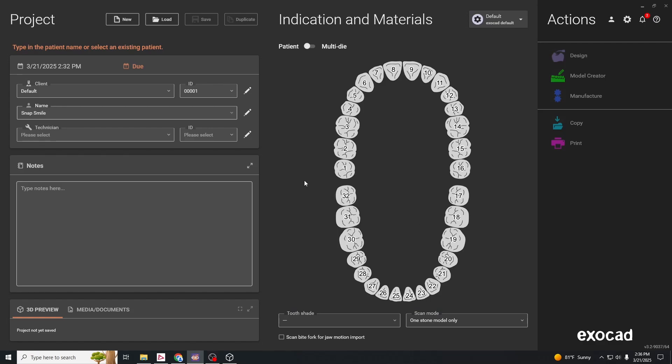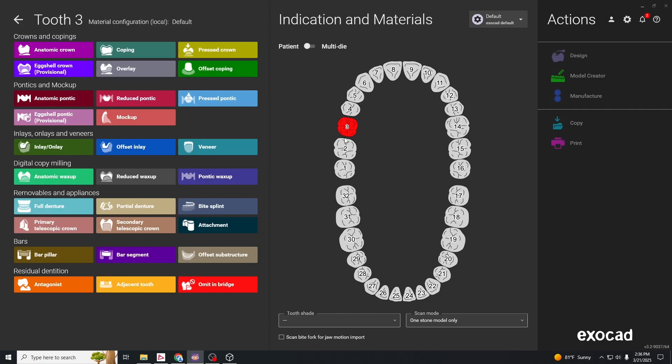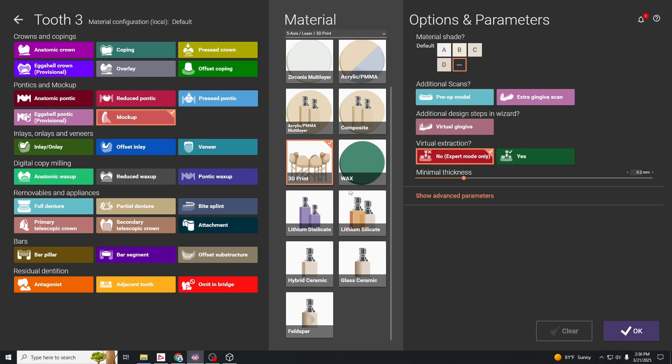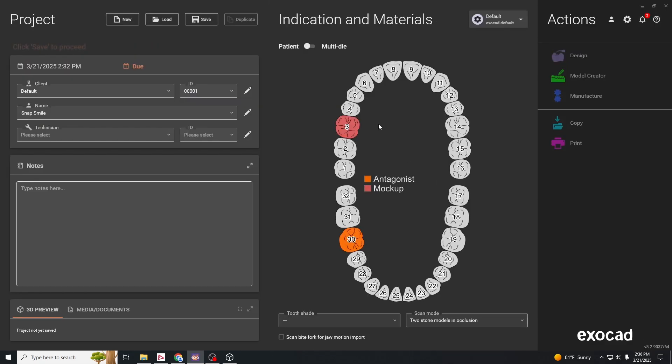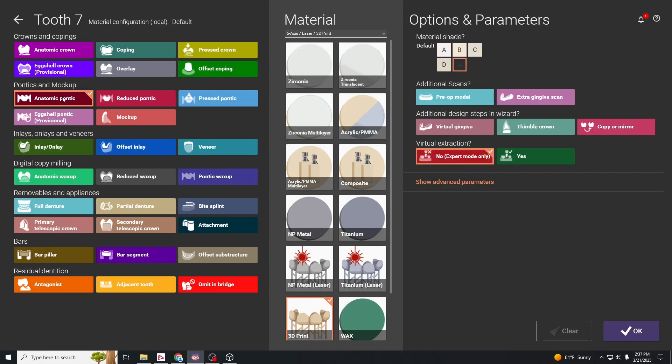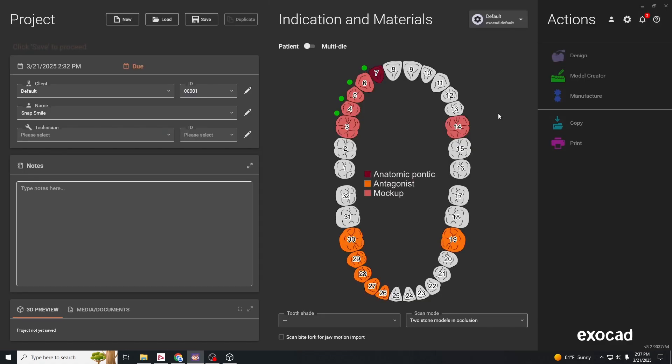In this video we're going to show you how to do a snap-on smile. Click a tooth that has a natural tooth in place, then hit mock-up, click on 3D print, and hit OK. Holding down the control button, you can select the other teeth that have natural teeth in place. On your pontic teeth, hit anatomic pontic and then hit OK.